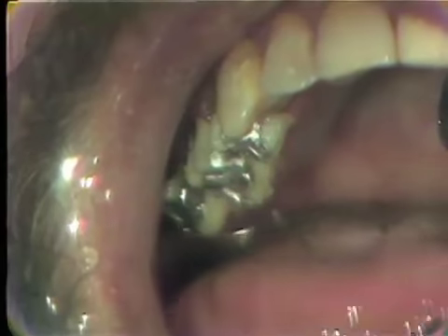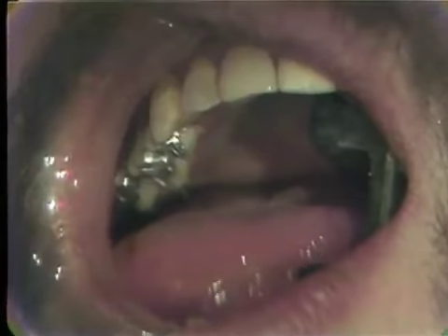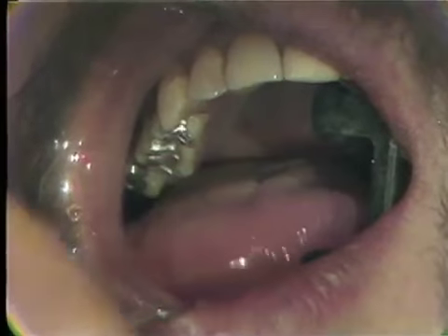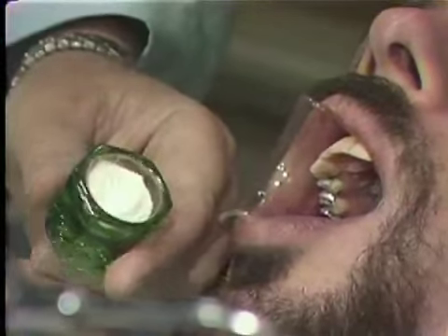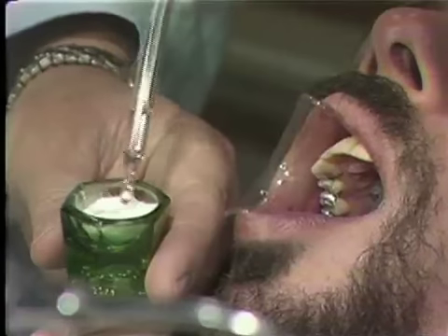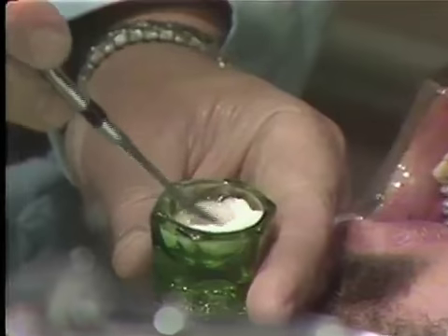We now go ahead and mix a liberal amount of Duralay in a dappen dish. This is a tooth-colored Duralay. You wet the Duralay.